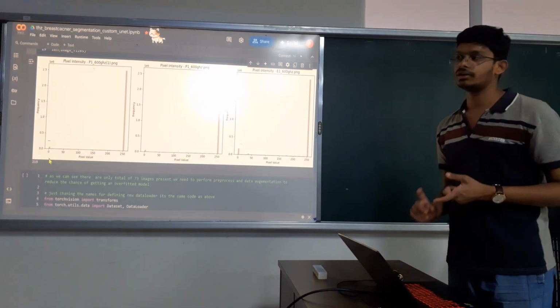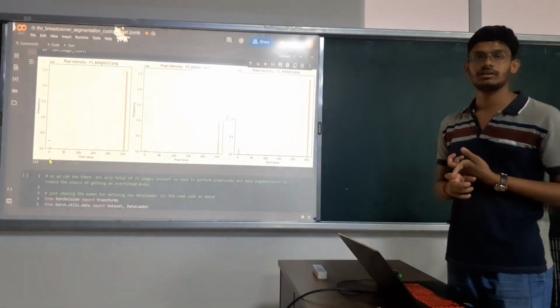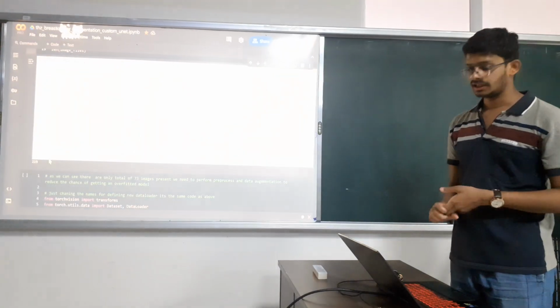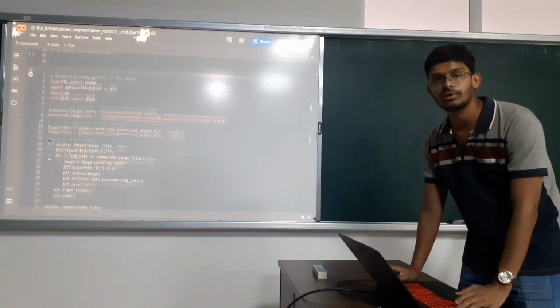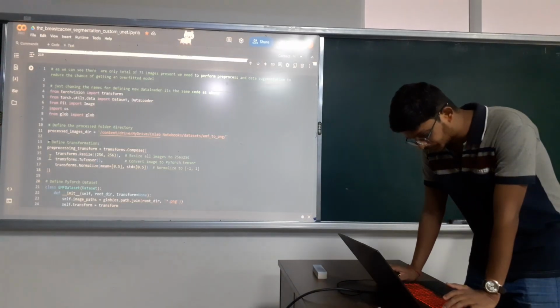Since I had 73 files in total from the Hyderabad hospital, after running the whole notebook thrice, it has been converted to 219 files. If I had not commented out the whole section from the above task, it would go on more and more and would take many more hours to perform the task.